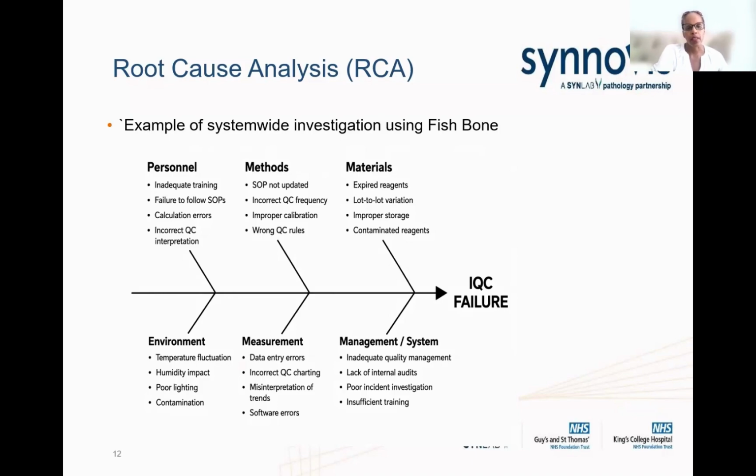When was the instrument calibrated? If you have to calibrate it and that data is accessible to you, it's important to look at that data and make sure what your QC levels are telling you also reflects that, or whether you need to actually revisit that calibration.